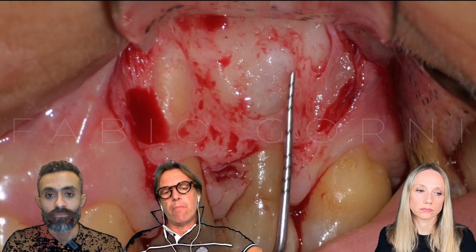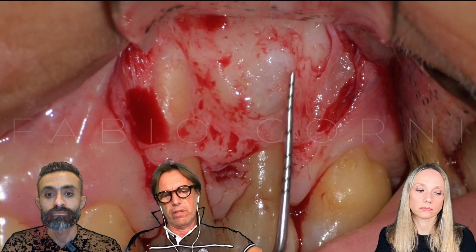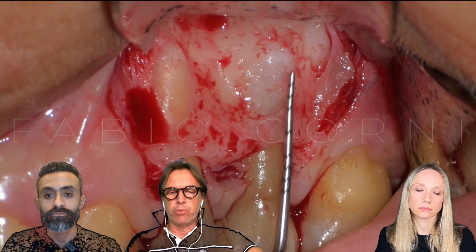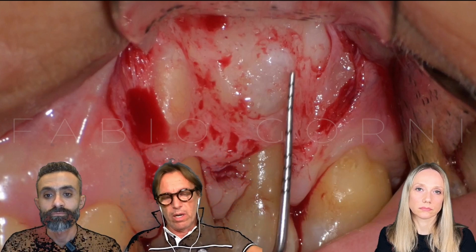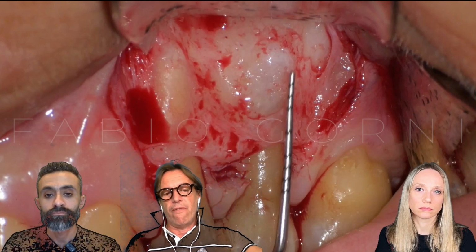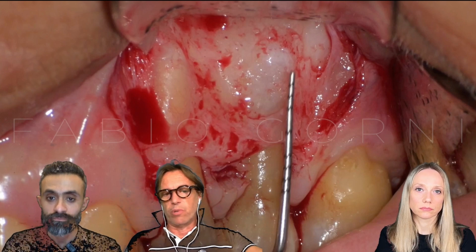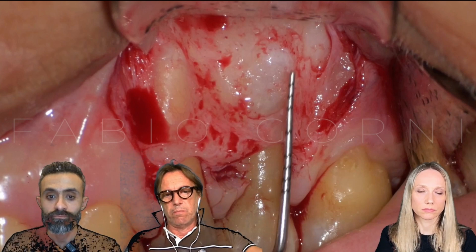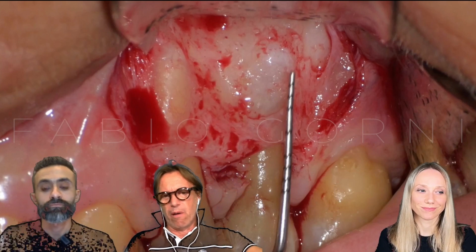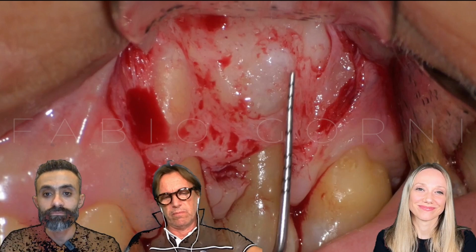The most damage that we can do to the nerve is when, with the periosteal, we push and push for maybe 1 hour in that area. So that's why we should have a very important fixed area for our periosteal, just to protect our mental foramen. But it's not a big deal in general. I know that colleagues are scared about the nerve, but it is the last problem in my opinion.